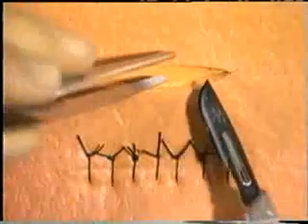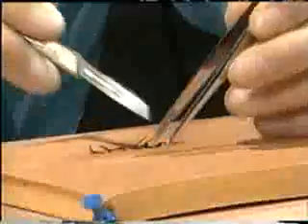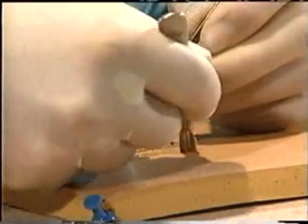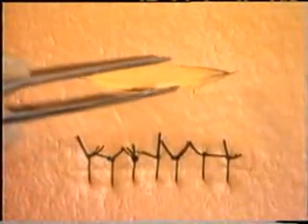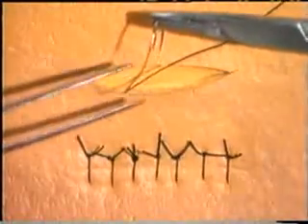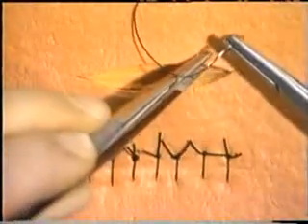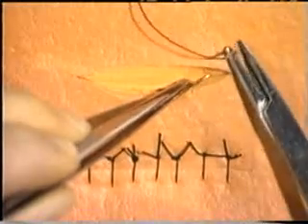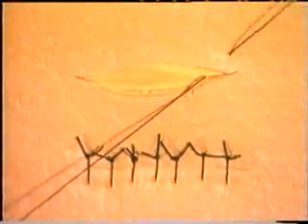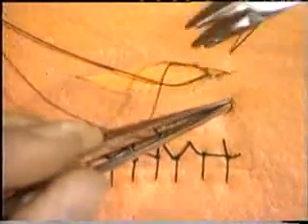It may not be possible to do this for an elliptical incision, and you may need to undermine the incision edges to increase mobility of the skin edge. In this situation, it is not practical to start in the middle of the wound, as such a suture will be under too much tension and therefore inaccurate. Thus, start at the end of the incision, inserting a suture at right angles and getting right down into the depths of the incision, and then come back at the other edge of the skin, again at right angles to the skin edge, and ligate that particular suture.